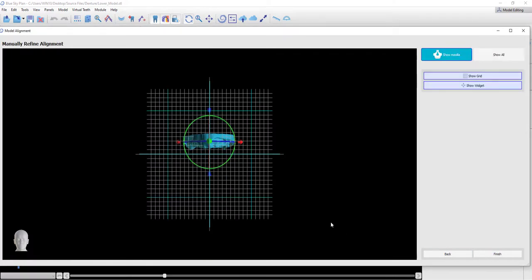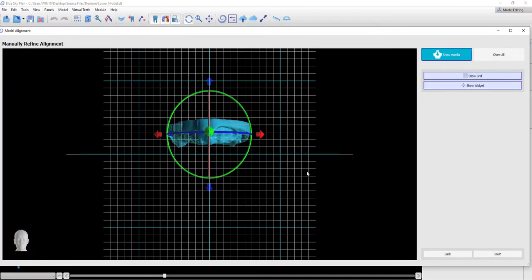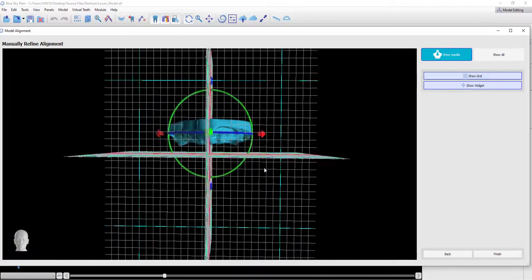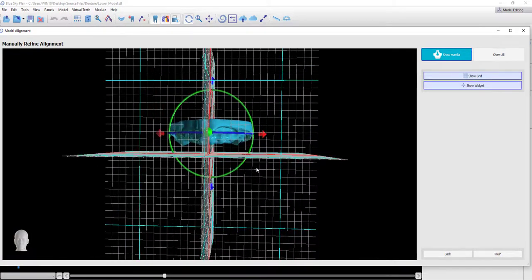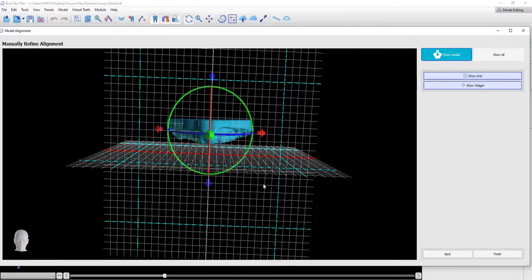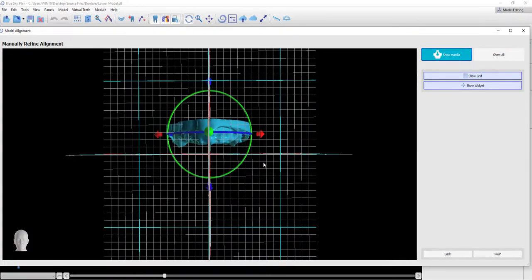And we can see now the model in space, and we do have the rotation and movement widget available in a situation where we want to fine-tune or improve the positioning if necessary.